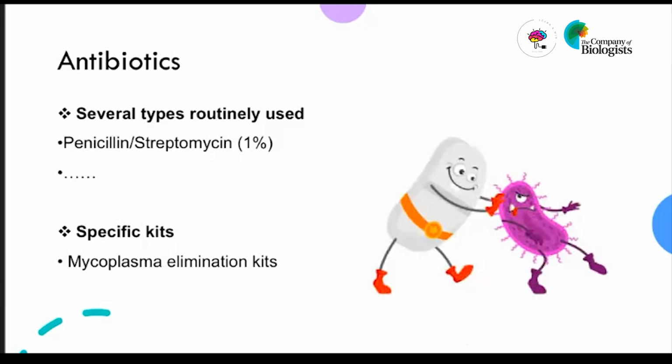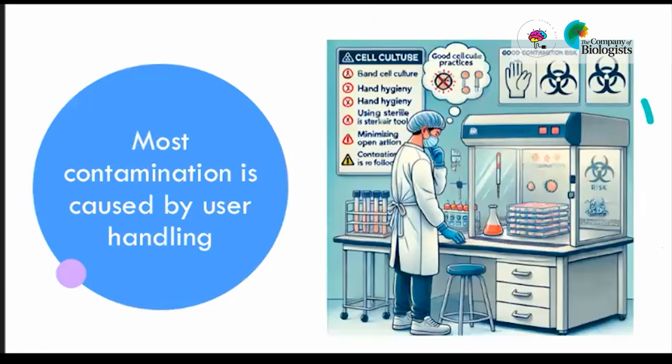To prevent contamination, we often use antibiotics, and there are several types routinely used, for example, penicillin, streptomycin. Specific kits may also be needed, such as for mycoplasma elimination. Unfortunately, antibiotics alone aren't enough, as most contamination is caused by improper handling.